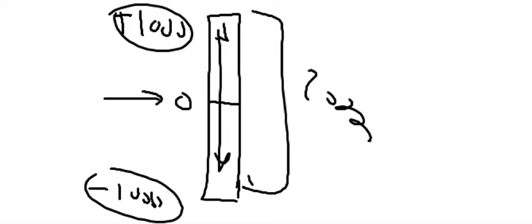Now, how do we use these 2000 shades to our benefit, to our eye? As the following. We tell the computer there are two words we have to know. First is the window width, and second is the window center. So it's WC. Okay? Now what's the W and what's the C?